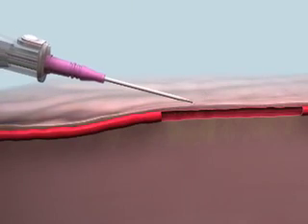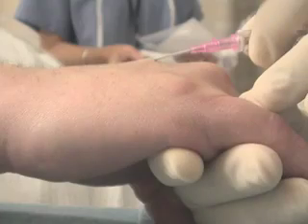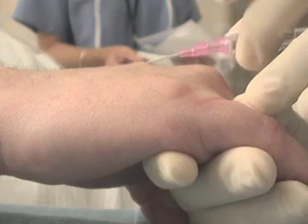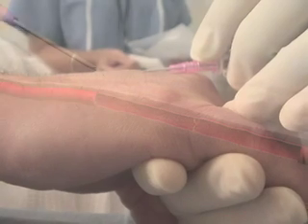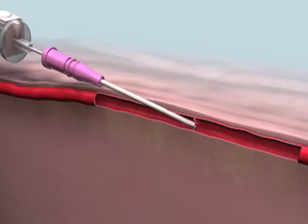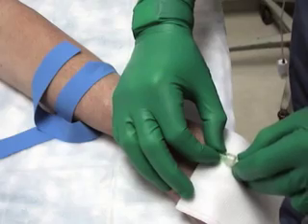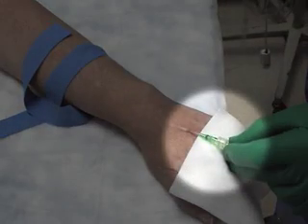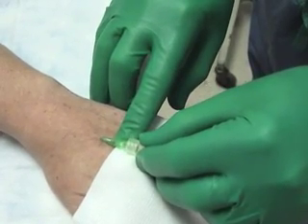to perform it. Blood might flash back into the chamber if the tip of the needle has entered the lumen, but the cannula has not yet entered the vessel lumen itself. This problem can be avoided by reducing the angle of the catheter and advancing the needle a few more millimeters into the vein. A valve within the vein may prevent advancement of an inserted catheter. If this occurs, hold the cannula hub in place, remove the tourniquet, and connect the intravenous tubing to the cannula. Running fluid into the vein may open the valve and allow the cannula to be completely inserted.